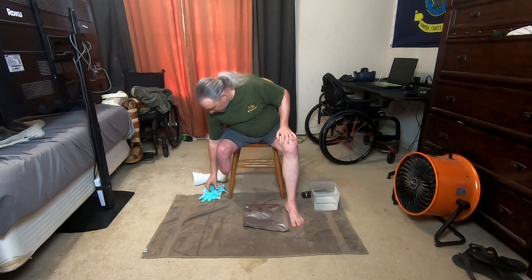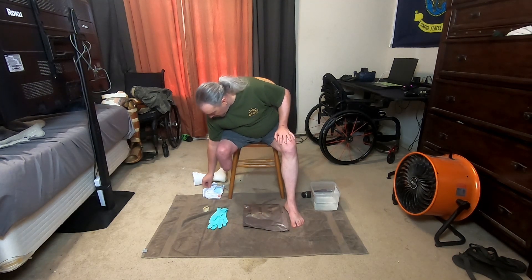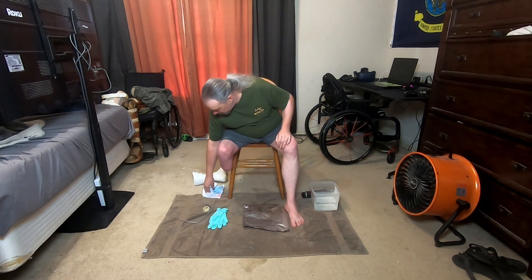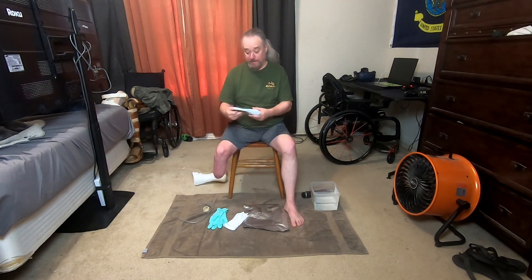We'll need a few things: gloves, a little tape, a little section of rubber hose — I'll show you that in a minute — some stocking net, and one of these AFO socks you can get online. It rolls on just like a sock.